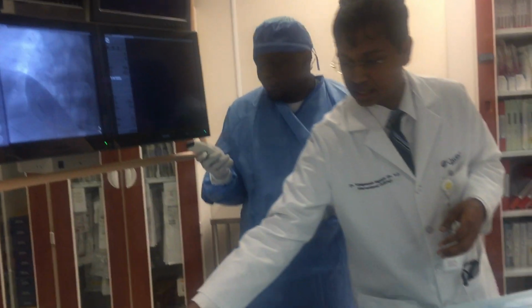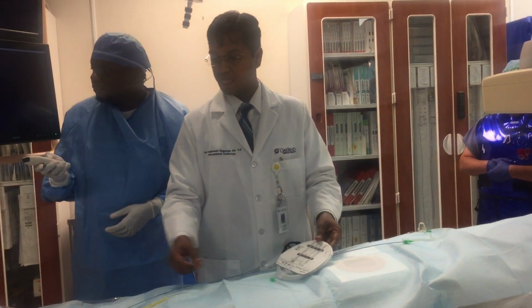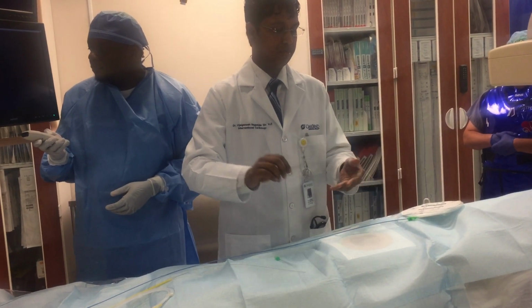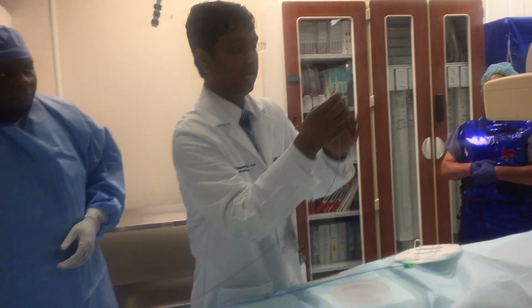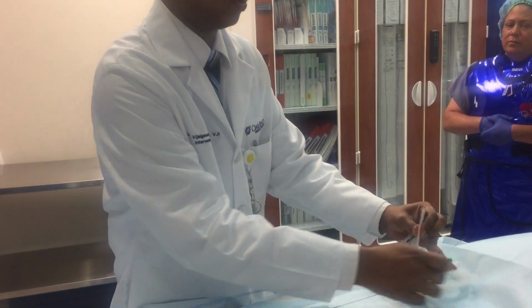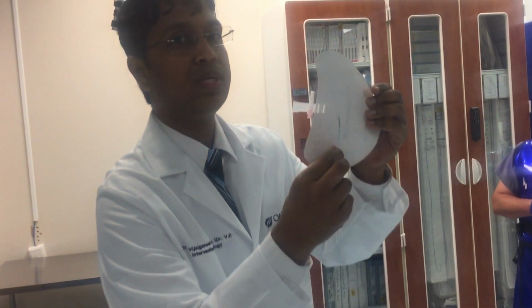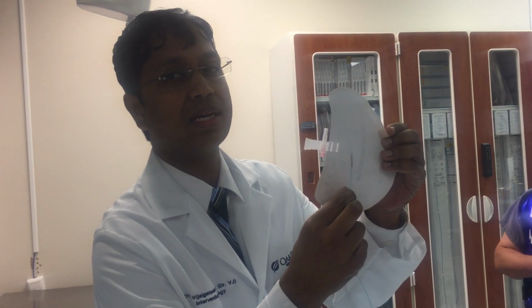So what we do is we pass wires into the heart, then we take some balloons and put in a stent. This is a stent, a heart stent. It may be really difficult to see on this view. I'm going to make it larger, so you may be able to see it better now. It's really tiny. The heart arteries are less than half a centimeter.